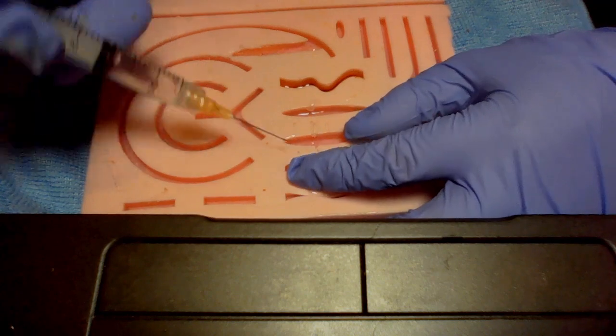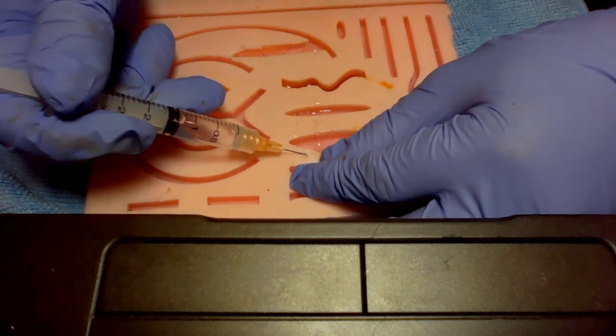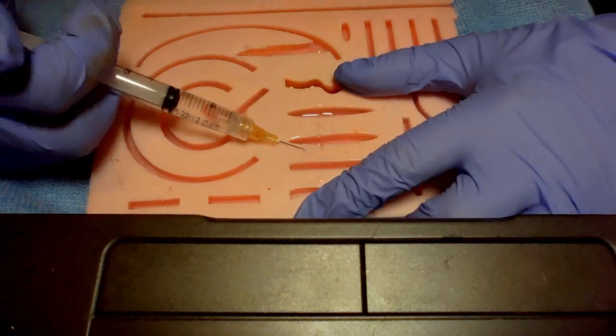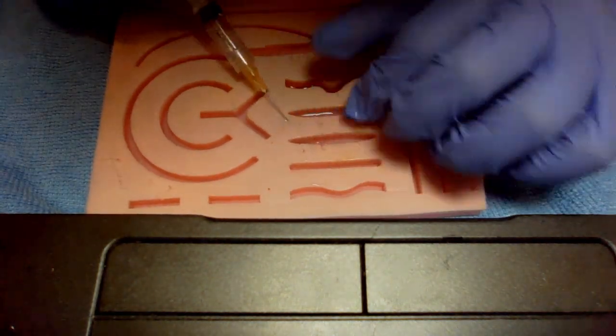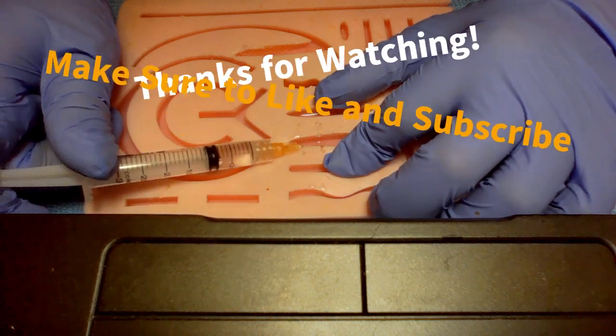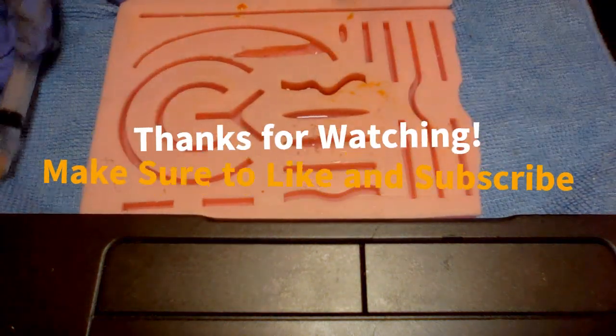And now for the subcutaneous fat, we're going to go all the way down. We're through the dermis. I'm in the subcutaneous fat now, and all I'm going to do is push. Make sure I get into the subcutaneous fat, and then I can push it in. And that's how to locally anesthetize.